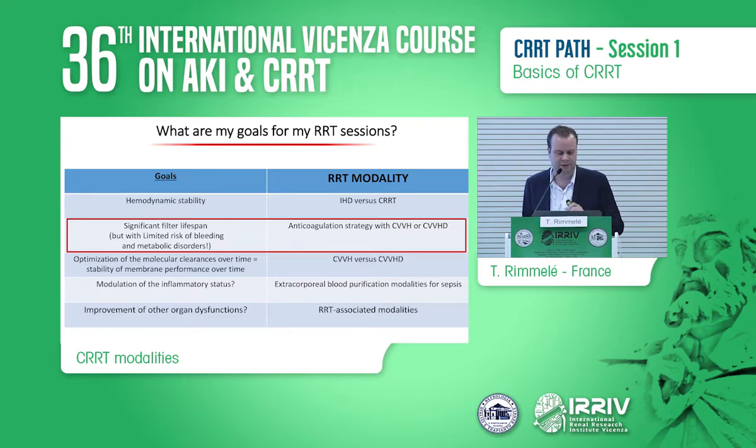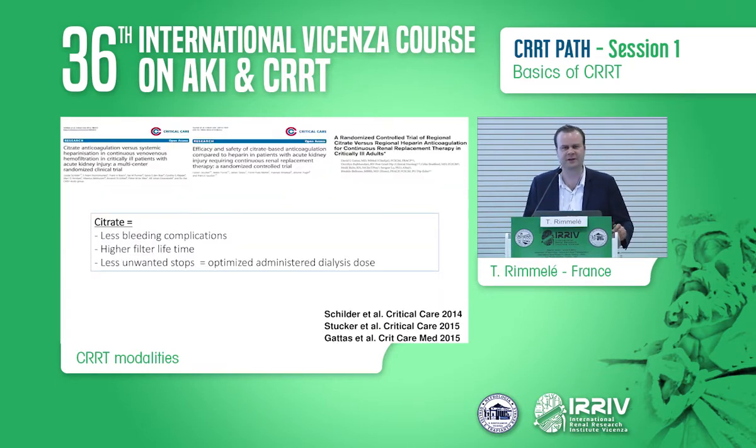Now for the significant filter lifespan that you want to achieve for your session. Of course you're going to choose a correct anticoagulant, and the new anticoagulant that we've been talking a lot about during the last years is citrate.